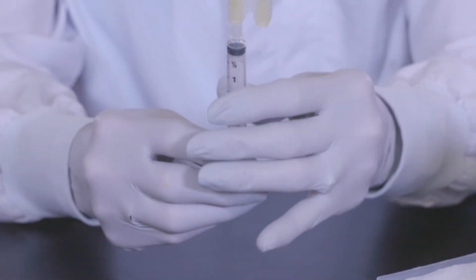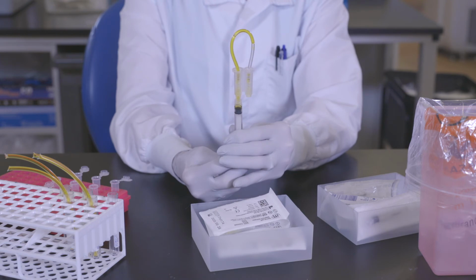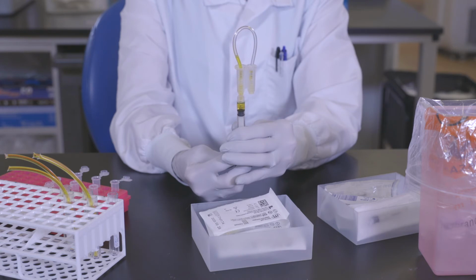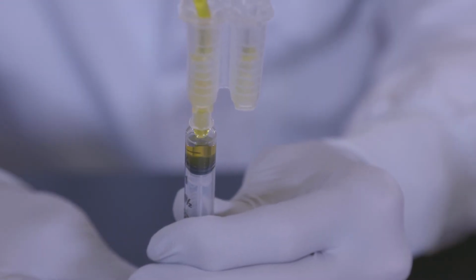Once you have visually confirmed that both ends of the segment were pierced successfully, gently pull the syringe plunger to withdraw fluid samples from the segment into the syringe. Withdraw a volume just over the sample volume required for the procedure or test. A bubble or bubbles may appear in the syringe.